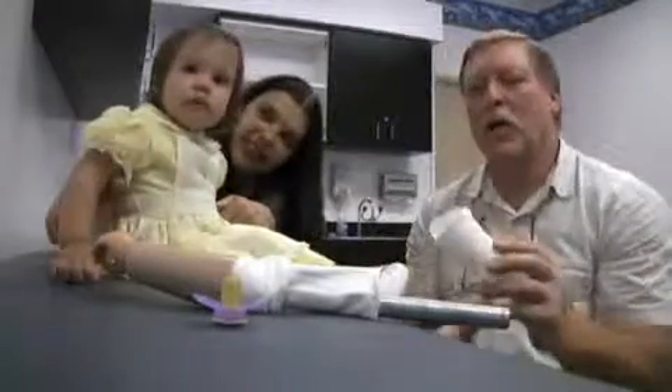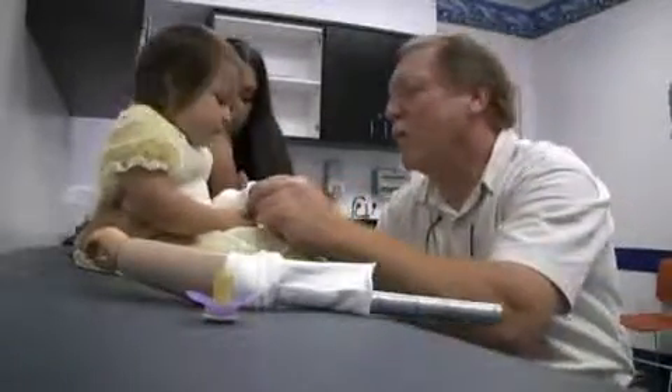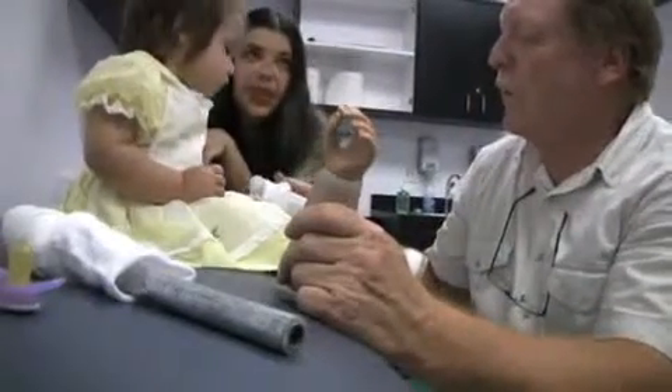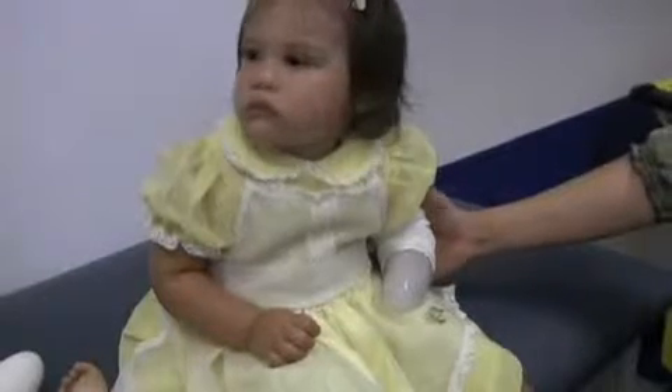So I'm going to send this socket home with them over the weekend for a few days and let her get used to it, because she really doesn't quite know what's going on. Isn't that nice? I think she'll leave it on.